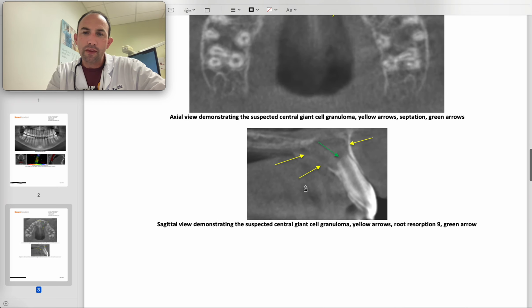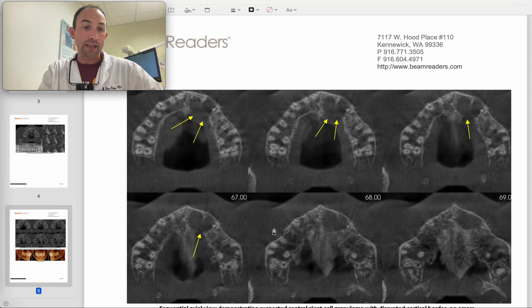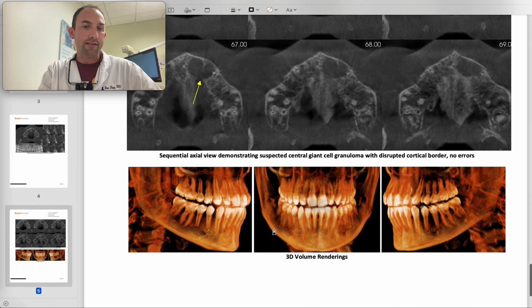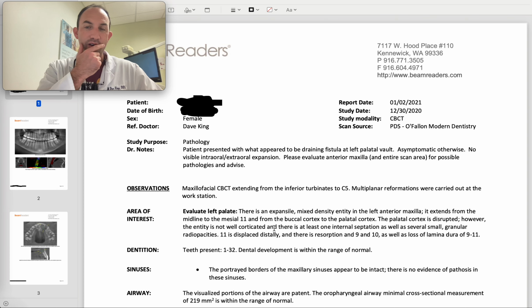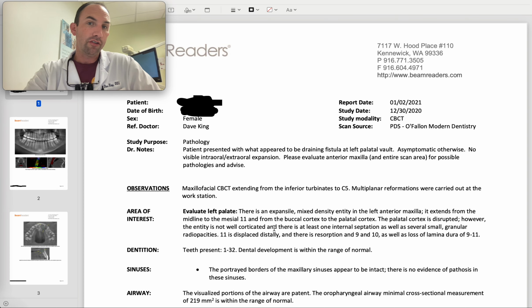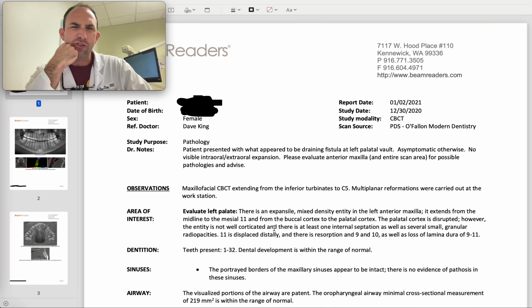Now we probably would have done that anyway, but having this, which we emailed to the patient's mother, this was a young lady in her late teens, but having this particular report that we could send to the mother and give to the surgeon, now the surgeon knows exactly what they're looking at. And I believe we also exported and gave this file to the patient on a little thumb drive. These files are about 200 to 500 megabytes depending on the exposure settings that you have.